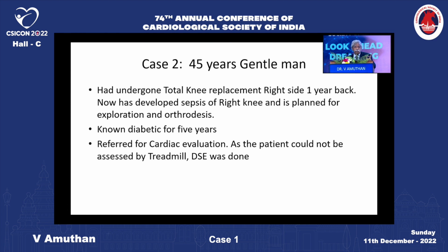It's very easy. The only point is that a skilled examiner should be there to record the single beat acquisition, multi-beat or single beat acquisition from the apex, the triplane, as well as the full volume at the base and at the peak. Very simple procedure. So before doing the treadmill, we can just place the transducer and do this.